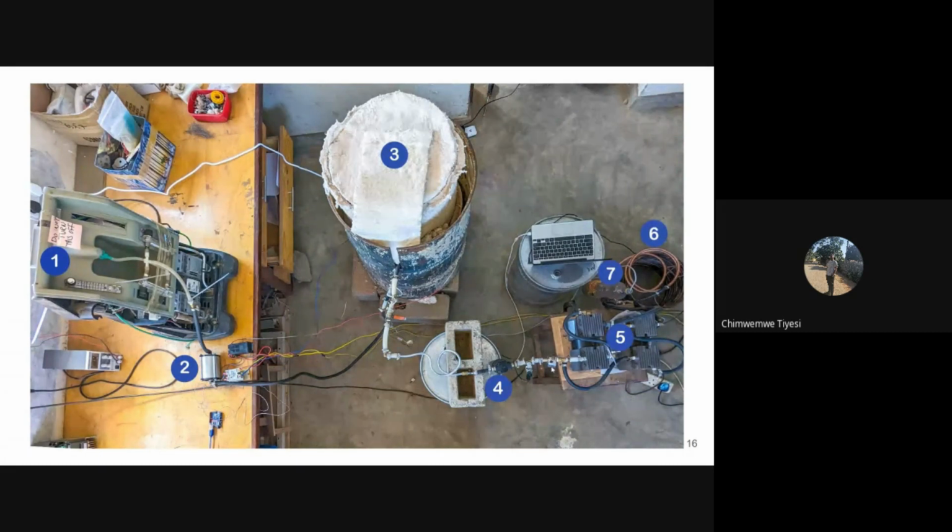These sensors are used as redundancy, just so that in case anything goes wrong, we can check on the other to see if they're giving the same results. The humidity of the stream of air coming out of the vacuum pump is monitored to determine when the regeneration process is complete. Through experimentation, we have determined that zeolite is adequately regenerated when humidity drops below 35%.